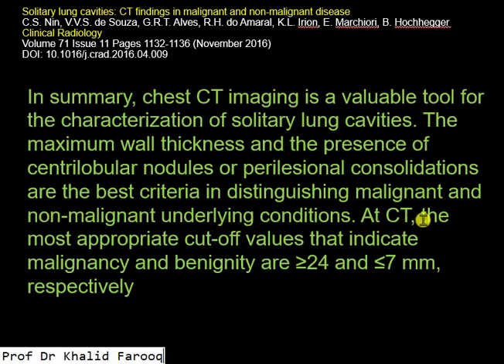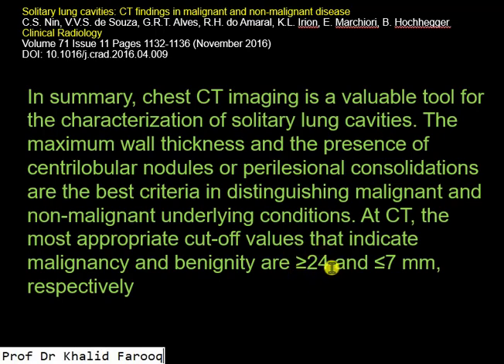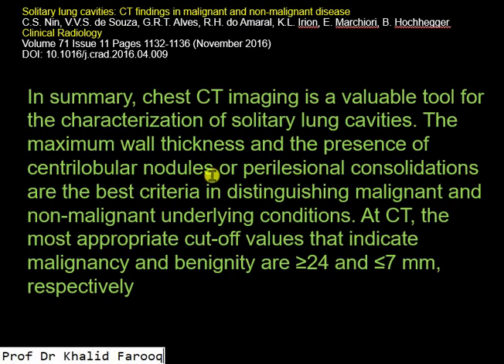The most appropriate cutoff values: in malignant lesions, there will be irregular wall thickening greater than 24 millimeters, while in benign lesions, walls will be smooth and thickening will be less than 7 millimeters. Similarly, in benign lesions we will see perilesional consolidation and centrilobular nodules. Thank you very much. Assalamu alaikum warahmatullahi wabarakatuhu.